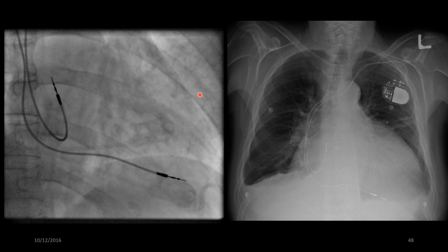And what this does is, usually there's an electrical problem with the heart. And so the reason that we have two wires, an atrial and a ventricular lead, is because there's a conduction problem between this portion of the heart and this portion of the heart. And so what that does is it detects an initiation of the heartbeat here, and because there's a conduction problem, it can't pass down here, and so the heart doesn't beat correctly. And so this compensates for that and hopefully stimulates this portion of the heart to beat correctly.